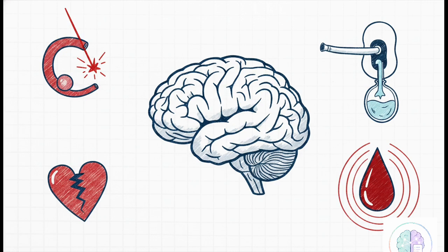If uncontrollable hemorrhage does happen, there's a crucial clinical pearl to remember. Keeping a fixed endoscope sheath seated just distal to the foramen of Monroe can actually act as a pressure escape valve. It allows blood to safely egress outside the skull rather than instantly compressing the delicate brainstem.